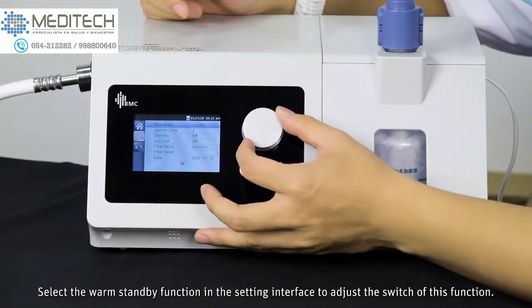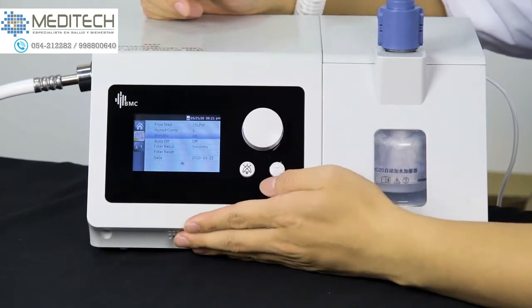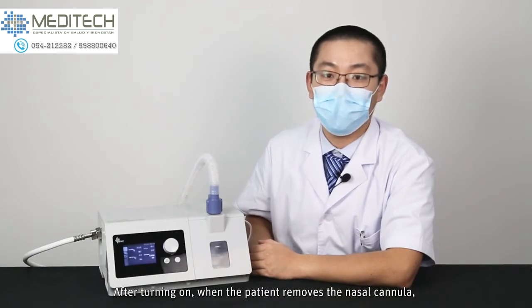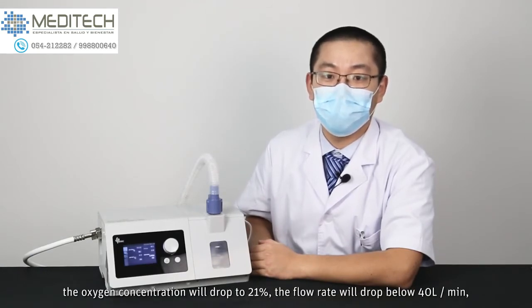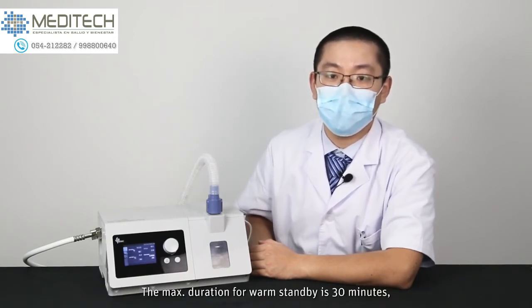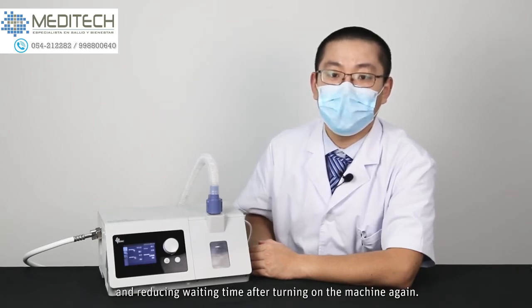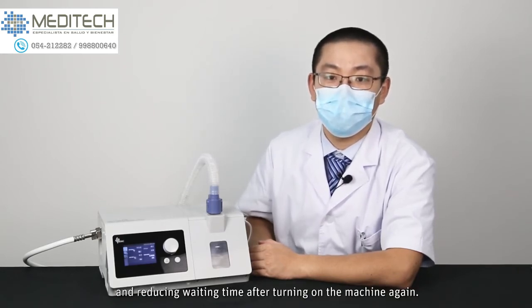The H-80 series has a warm standby function. Select the warm standby function in the setting interface to adjust the switch of this function. After turning on, when the patient removes the nasal cannula, the oxygen concentration will drop to 21%. The flow rate will drop below 40 liters per minute, and at the same time keep heating. After the patient puts the nasal cannula back on, the normal working conditions will be resumed. The max duration for warm standby is 30 minutes, allowing treatment to be started quickly after a short leave, and reducing waiting time after turning on the machine again.